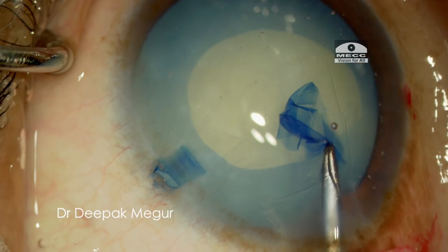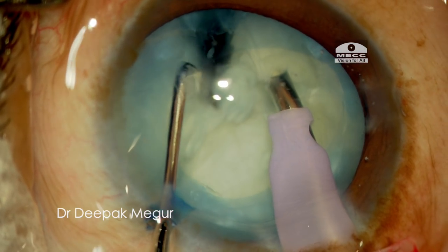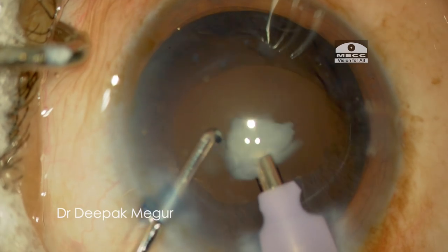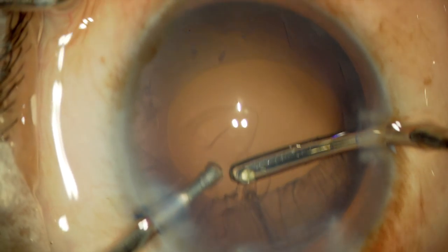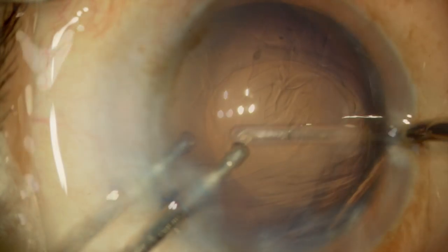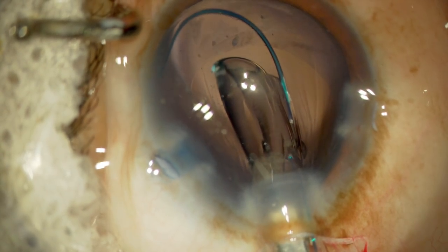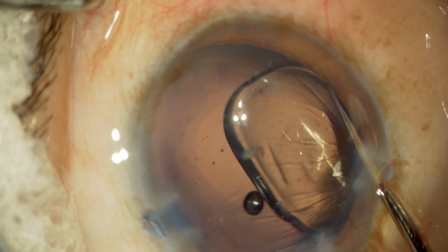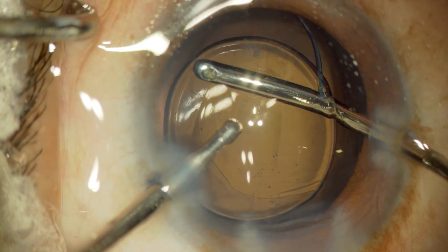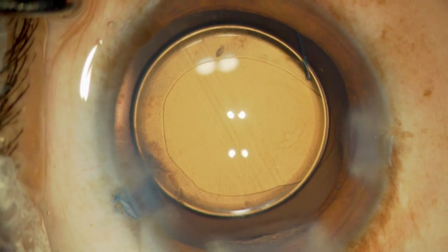Once the rhexis is done, the case becomes a routine one. The nucleus is quite soft and could be chopped and separated quite easily. Each fragment is consumed at the pupillary plane, and then the cortex is aspirated. A multi-piece hydrophobic acrylic lens is placed in the capsular bag. The OVD both in front and behind the lens is gently aspirated out, and the case is done.